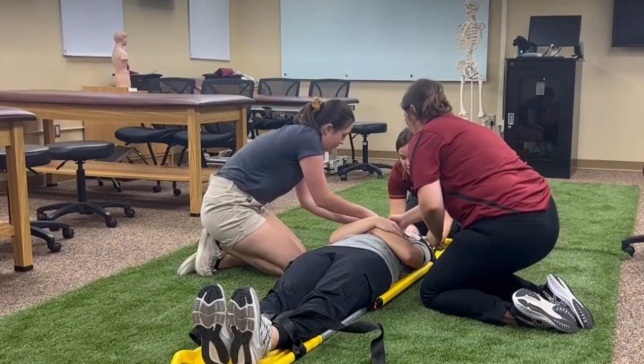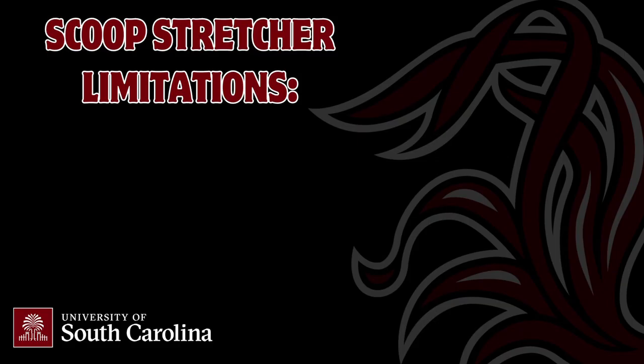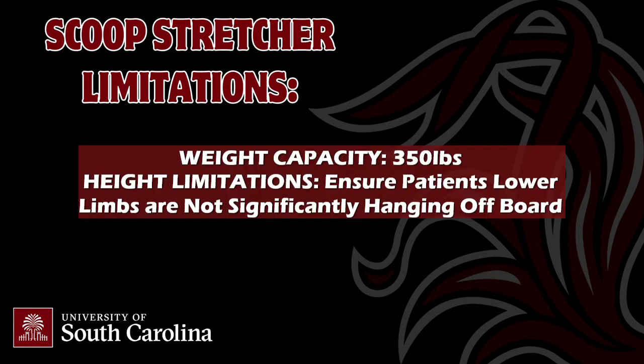At this point, after the patient has been successfully loaded onto the scoop stretcher, you'll need to make sure you use a C-collar or some other form of stabilization to keep the neck aligned during transport. A scoop stretcher provides significantly less flexion during application and increased comfort for the patient, but it's important to note that it does have some limitations. This can include a weight limit of 350 pounds and a slight height limitation due to the length of the scoop stretcher.